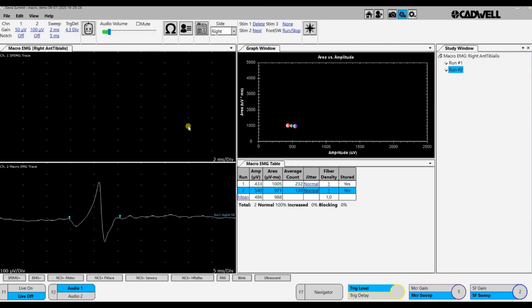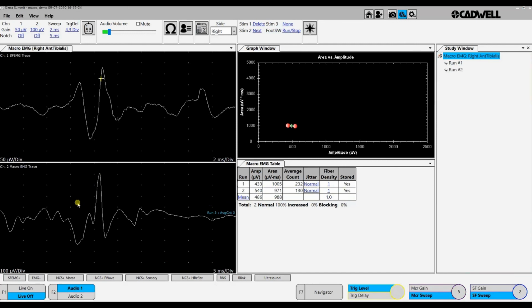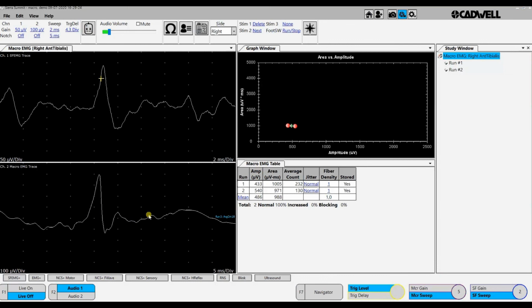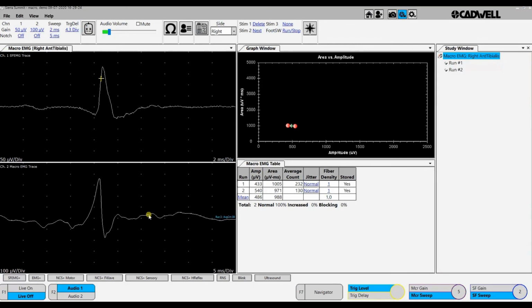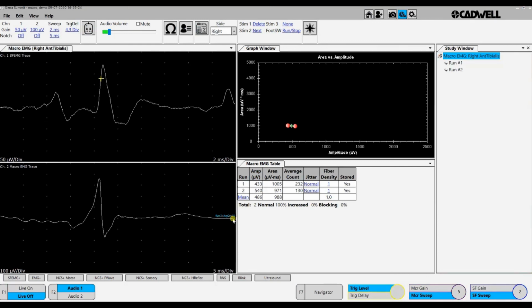I move the needle again. We start to average, and now in the beginning it's a very irregular baseline, and if we go on for a little while, now we have 64, now we have 70, now we have 80, 100, and now I think the baseline is very nice.